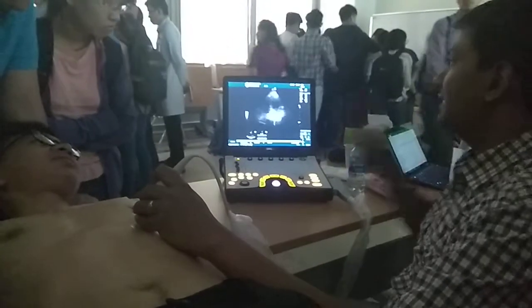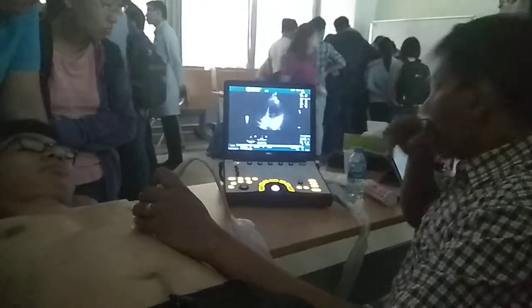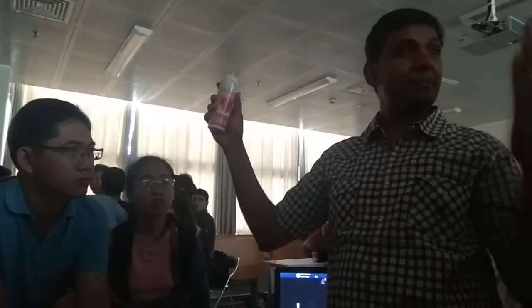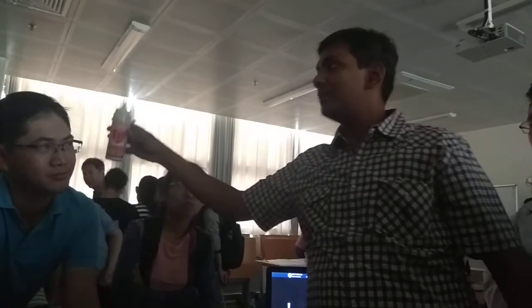Now I have this. Firstly, the depth of the image. I didn't tell you this before. These are some important principles. What depth must you have? It must be optimized for the structure of interest. So if you want to read this line, what is the best depth for you? Is this good? No. So tell me. No. So you come back.